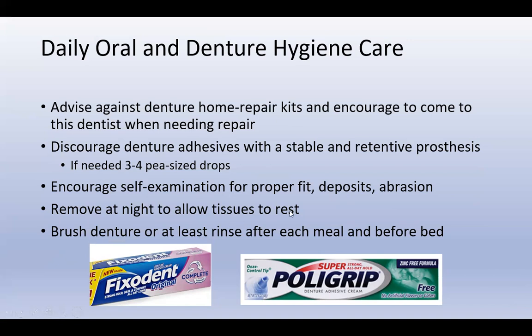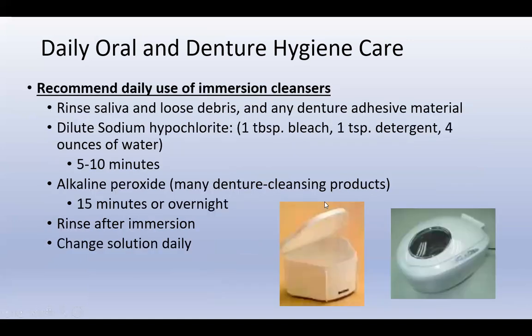Remove at night to allow tissue to rest. Very important, many people don't realize how important this is. That's a huge thing with the irritated tissue or the candidiasis. Patients could still get it even if they take it out at night. They could still be susceptible to those things, but somebody who never removes their denture is higher risk. Brush the denture, or at least rinse after each meal and before bed.